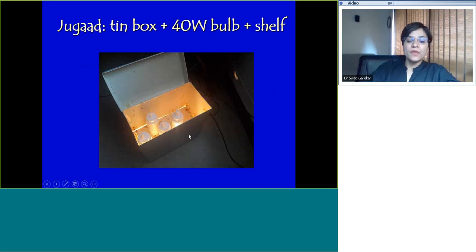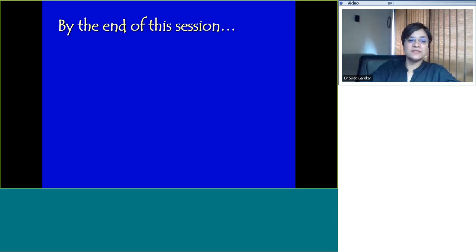Here's the tin box that we use for our gel warming. We put a bulb below that shelf and place the warmer gels on that. Much better than this are the infant bottle warmers that are available online and in supermarkets. Make sure your gel isn't too warm. You're not going to be wanting to hurt the baby or the probe, which is also sensitive.